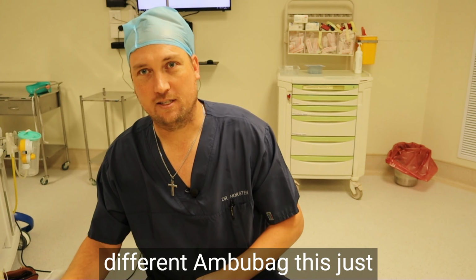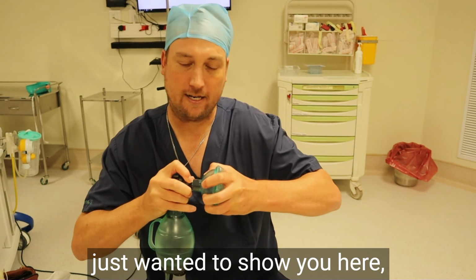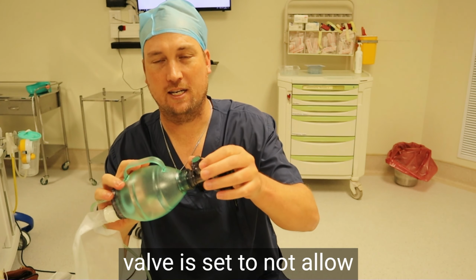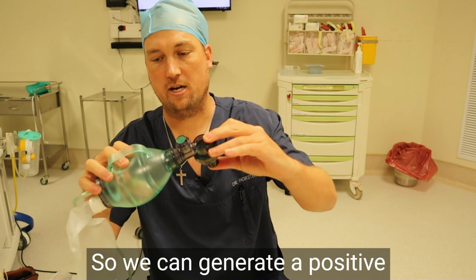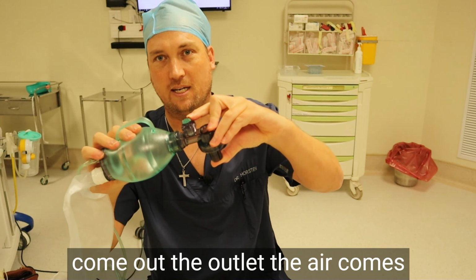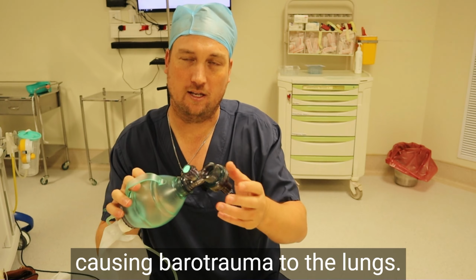So then just looking at a different ambu bag, this just happens to be a pediatric ambu bag, so very similar, but I just wanted to show you the pressure release valve. This pressure release valve is set to not allow you to generate pressures more than 40 centimeters of water. So we can generate a positive pressure, but as soon as I squeeze too hard, the air doesn't come out the outlet, the air comes out the pressure release valve.